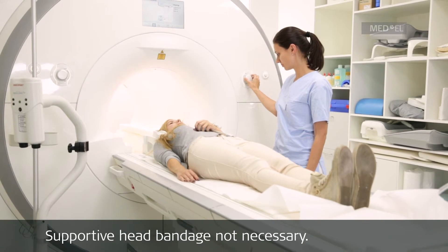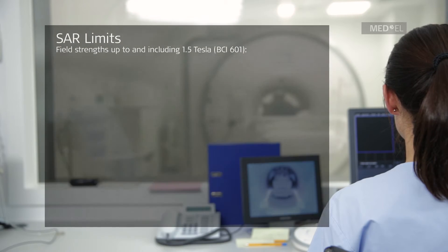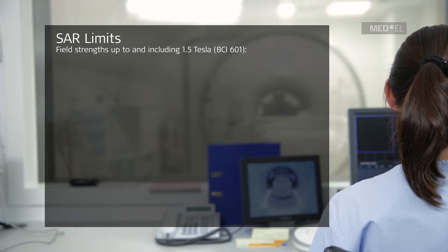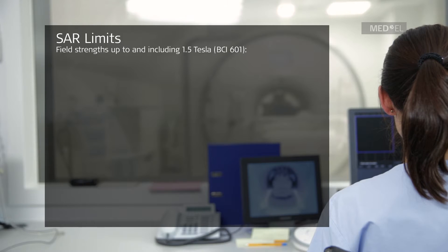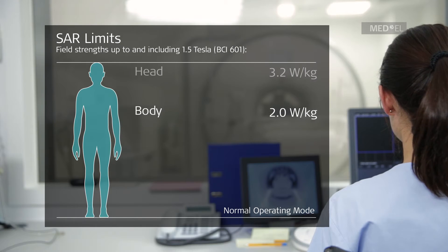A supportive head bandage is not necessary. Patients with the BoneBridge BCI-601 Bone Conduction Implant System can be scanned at field strength up to and including 1.5 Tesla. Run sequences in normal operating mode only — that means the head SAR is limited to 3.2 Watt per kilogram and the whole body average SAR is limited to 2 Watt per kilogram.